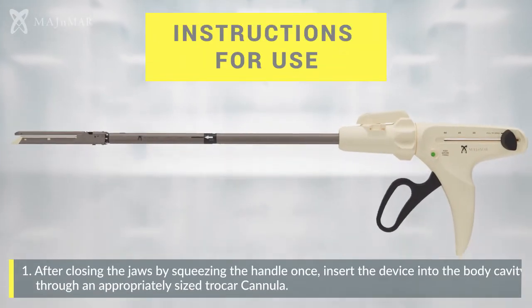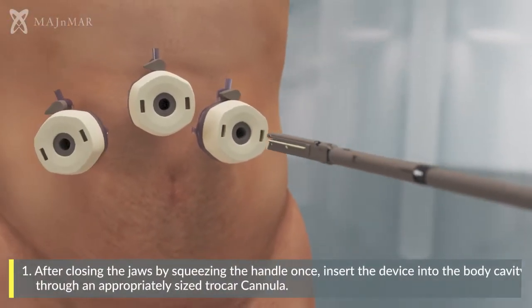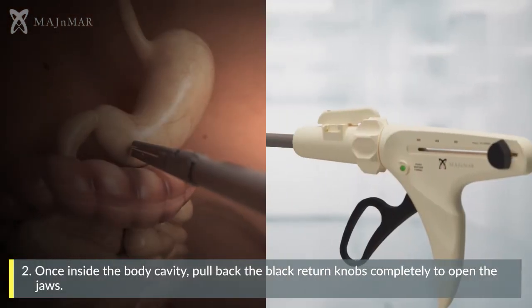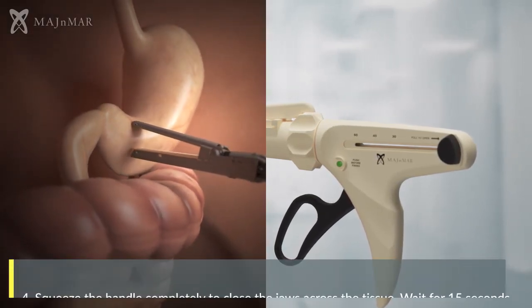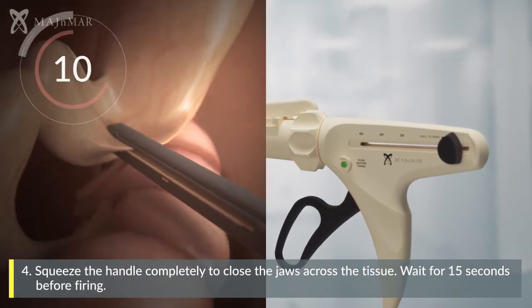After closing the jaws completely by squeezing the handle once, insert the device into the body cavity through an appropriately sized trocar cannula. Once inside the body cavity, pull back the black return knobs completely to open the jaws. Apply the device across the tissue that will be transected. Squeeze the handle completely to close the jaws across the tissue and wait for 15 seconds before firing.